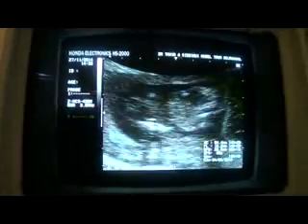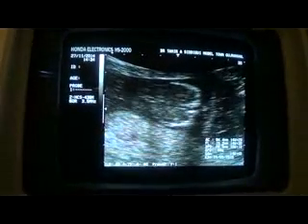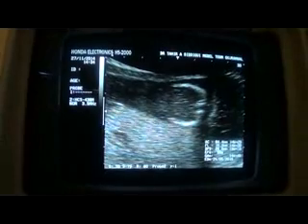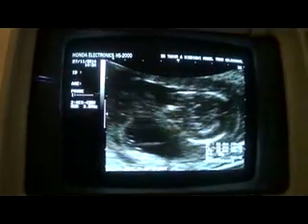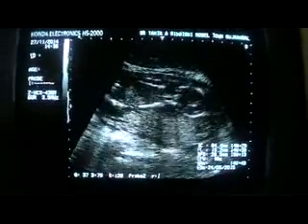So, no kidneys, no evidence of any kidney, and no evidence of urinary bladder, no urinary bladder seen. So this is our case of the day. Thank you very much.